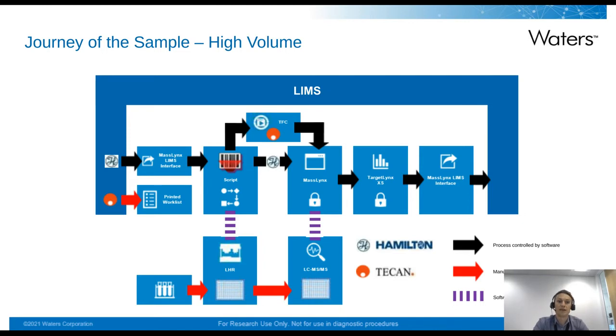On both the Tecan and Hamilton systems, sample tube barcodes are scanned and tracked through the extraction process, and so the final location of all samples are known. Once the run is complete, a file is generated with this information present. In the case of the Tecan, a file converter is used to allow the sample ID and well position to be combined with a template containing the LC-MS/MS method information to create the sample list in MassLynx.